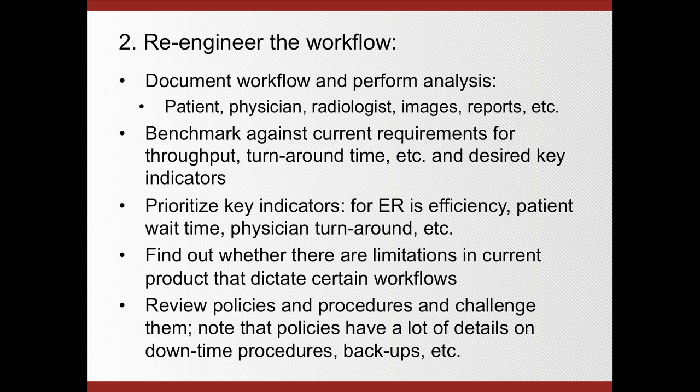And you also want to review policies and procedures. You want to challenge them. If this is the way it's being done, why is it the way it's being done? There are a lot of details on downtime procedures and on backups. For example, if the current procedure is that you make a tape backup every day, maybe with a new system you can substitute that tape backup by having an automatic backup made over a connection to an application service provider, an ASP. There are a lot of opportunities for optimizing the workflow if you look at all the individual policies and the way you do things right now, and then look at potential new system capabilities.